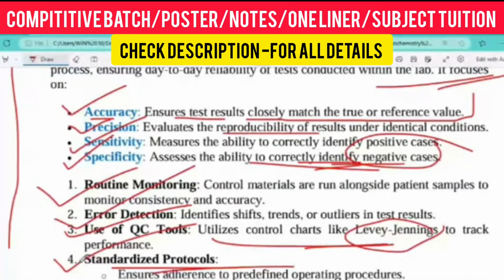Internal quality control does not require any kind of external body. Keep in mind that internal quality control means what happens in your own laboratory particularly. It does not require any external body. Okay, you are enhancing the internal status of your laboratory.